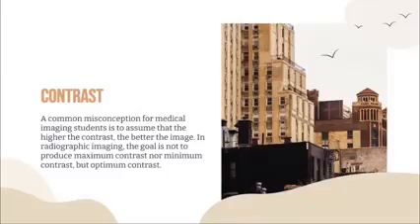Kabalo naman mo anak. Pagtaas ng KVP, bumaba ang contrast. Pagbaba ang KVP, yes, mas taas ang contrast. Okay? Use of grid, pag magamit mo grid, image contrast is increased. And if tight ang inyong collimation, image contrast is also increased.